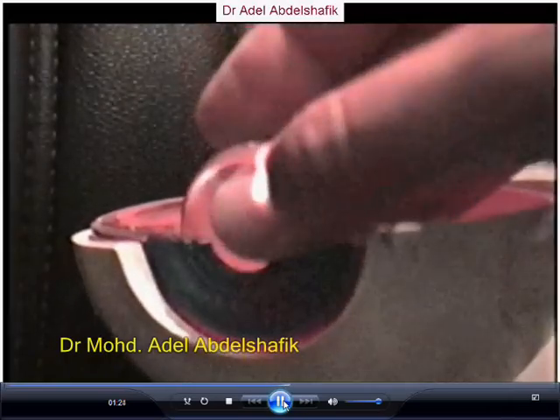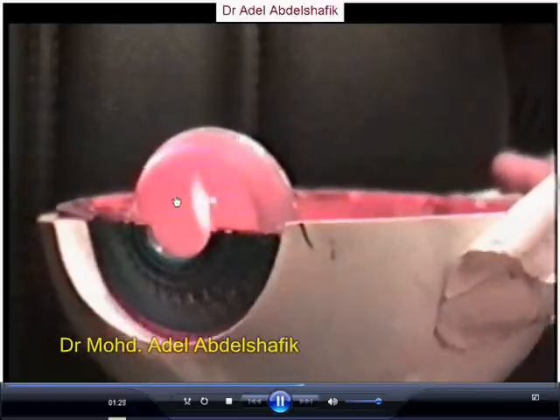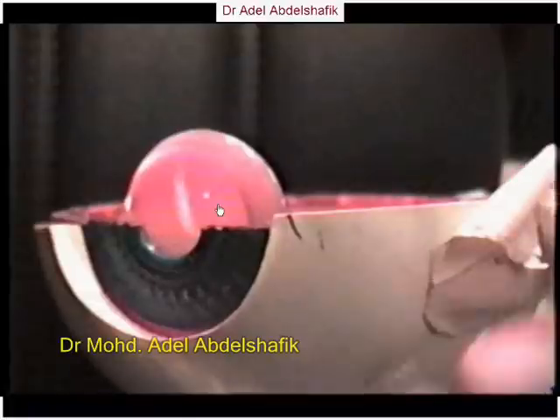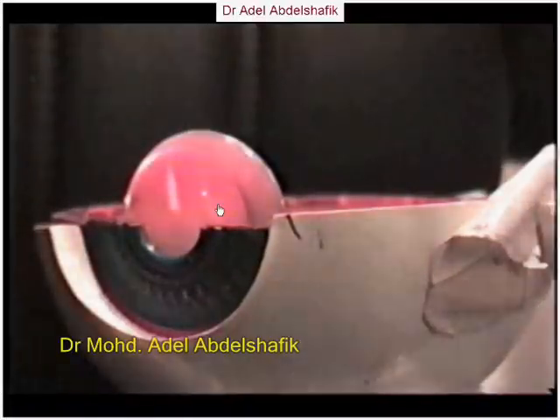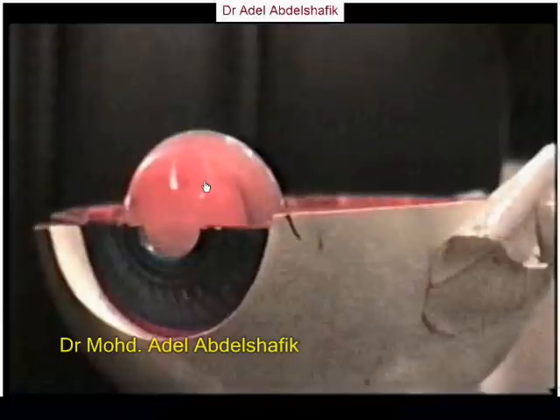I'm taking the cornea out, putting the lens in place. Now this is the section in the lens. This is the anterior surface of the lens, and behind this is the posterior surface of the lens. I'm dimming the light of the room to see things better. This is the equator of the lens, and this is the section of the layers of the lens.